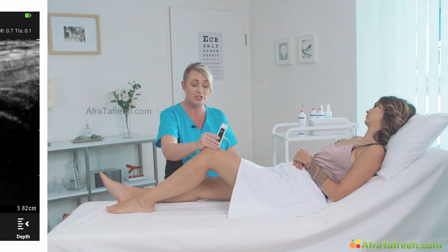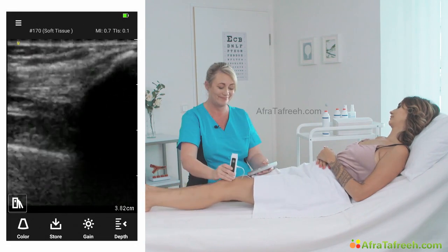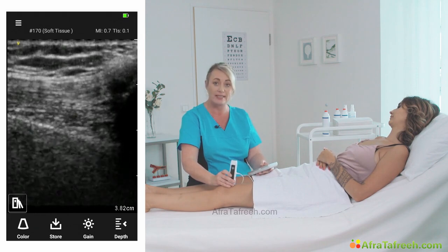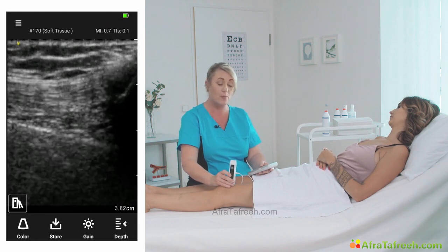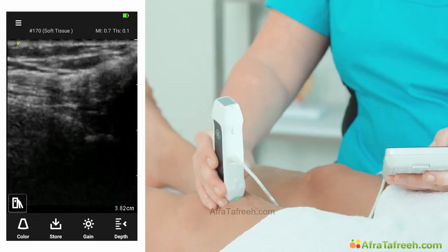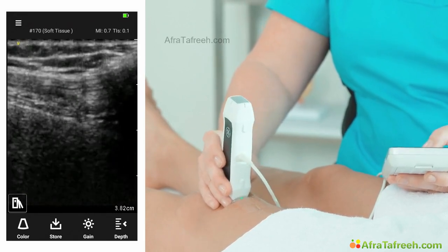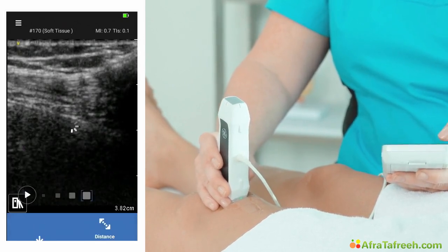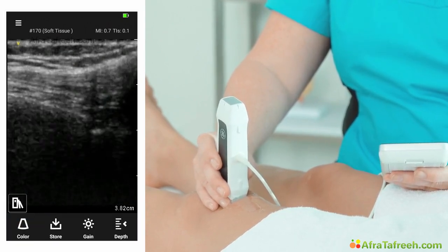So I'm going to ask my patient just to slowly straighten their leg down until it's completely extended. And you can see here in that dynamic study that that fluid has completely disappeared now. Again, in a patient with a significant amount of fluid, there will be still visible fluid there. And again, I'm just going to slide the transducer side to side and we can see the fluid's completely disappeared. You'll also notice now the quadriceps tendon has these dark or anechoic areas coming down. That's because we've got anisotropy occurring due to the fact the tendon's not on full stretch.